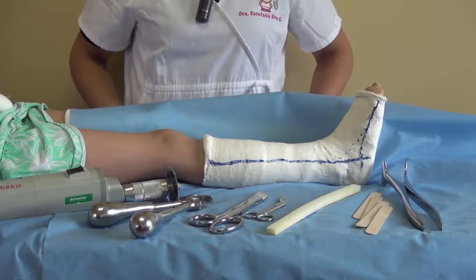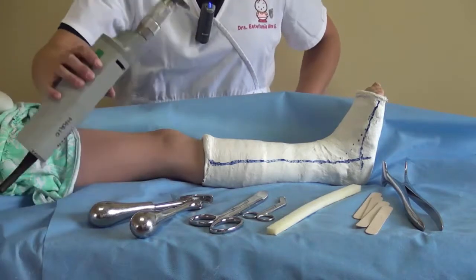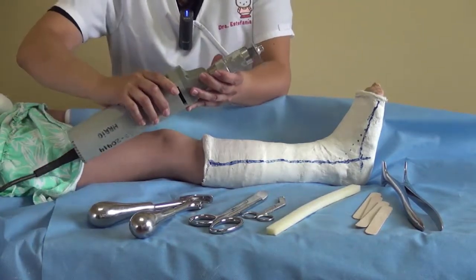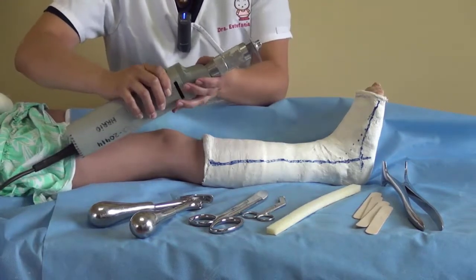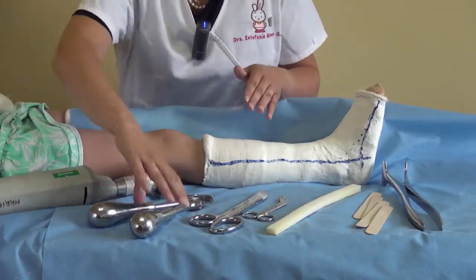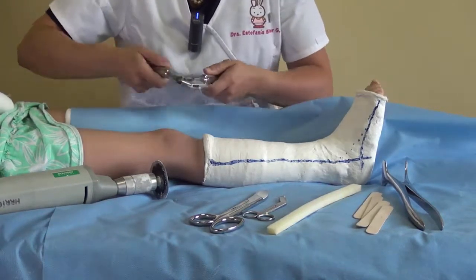We came to the final part. We have to remove the cast. For that we have to use this saw — it's an electric saw. It doesn't cut, you can see. But if you don't have this one, you can use this shear or this cast cutter.